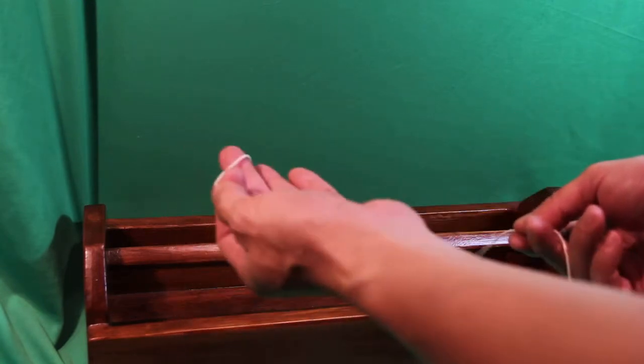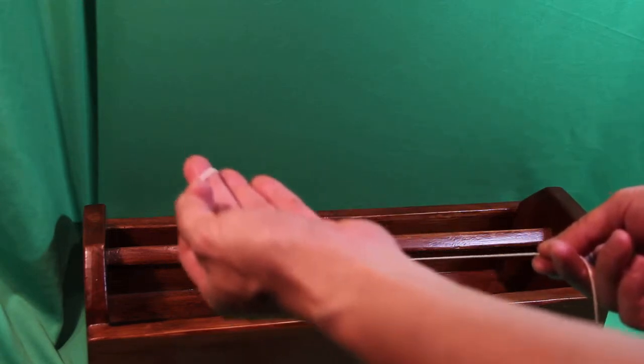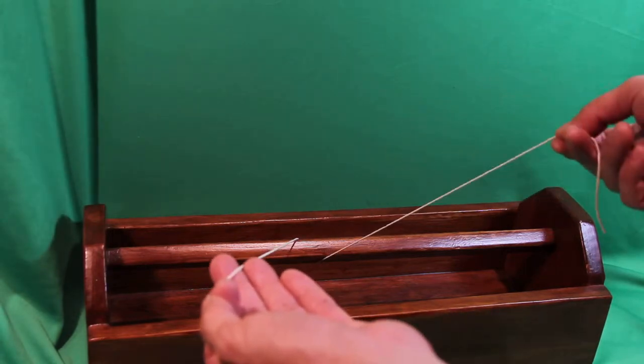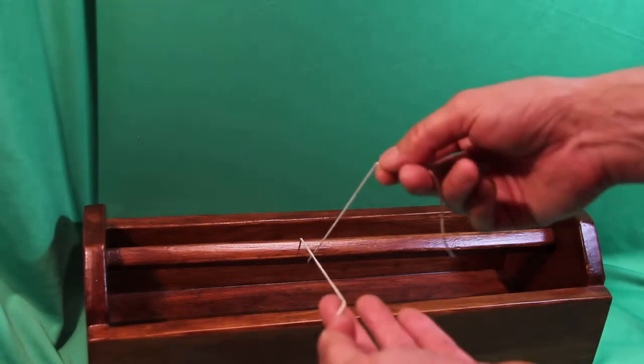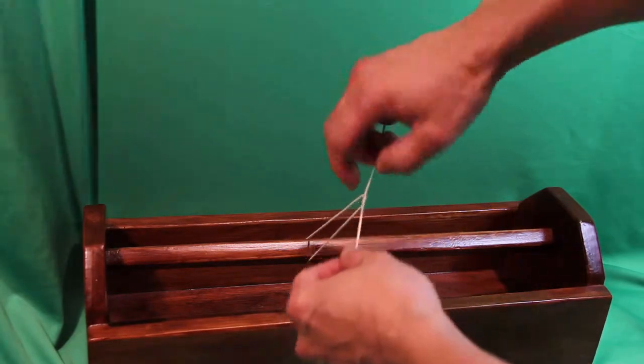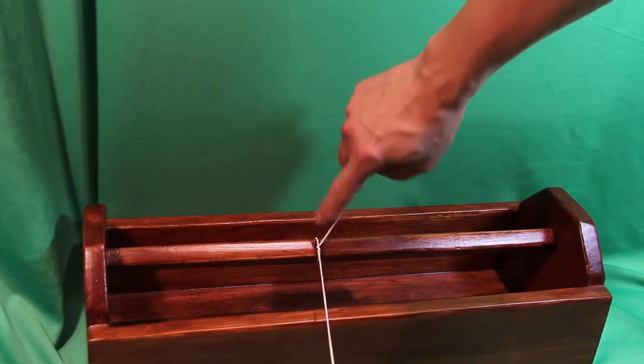You take your left hand and take one strand and make that your upper hand, upper side, and your right hand for the lower strand on the lower side. So this configuration. Because when you tie it down, because it's crossed to start with, your throw will be flat.